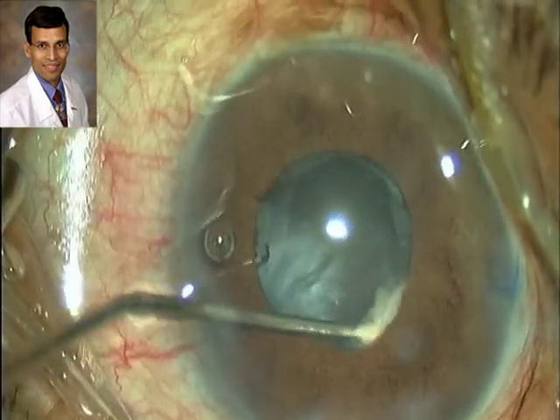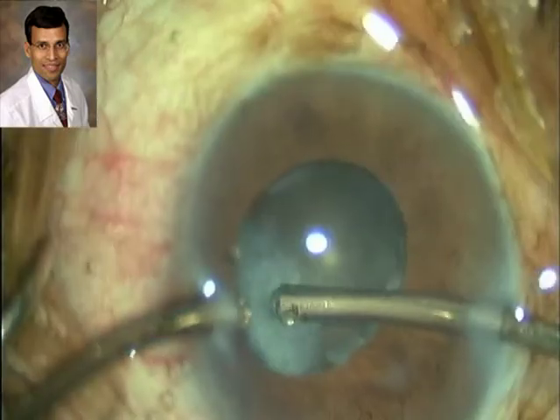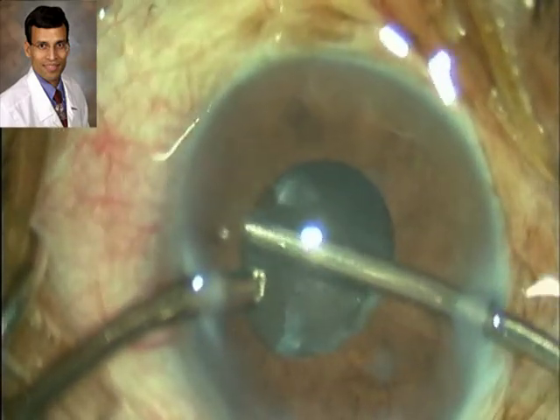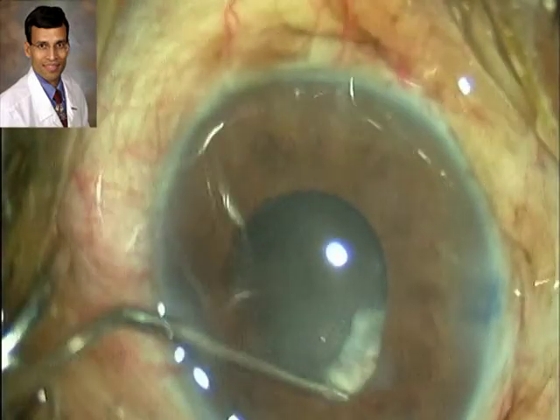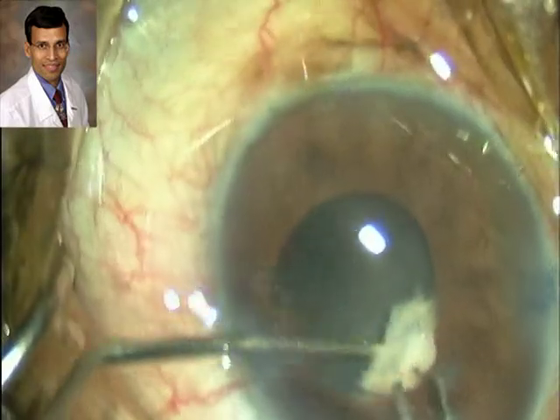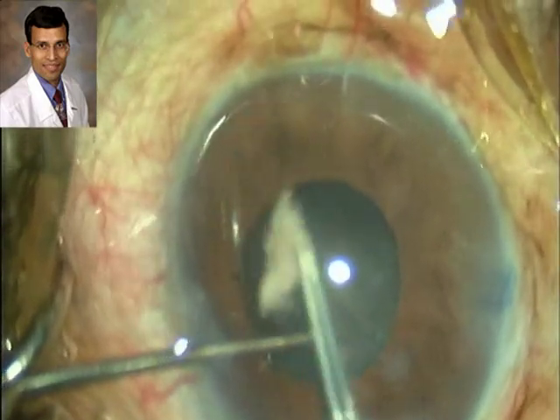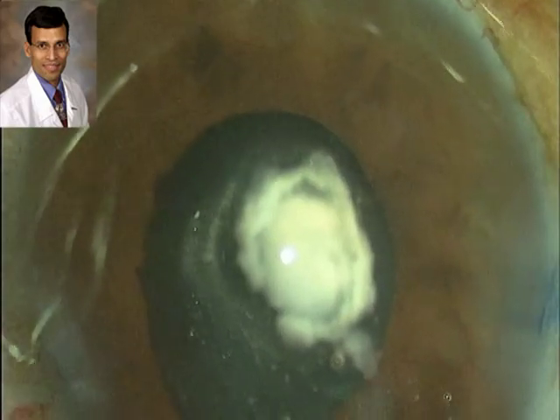Now we can see that there are some membranous bits which are lying under the iris, and they may be very tenacious to remove. We perform an irrigation aspiration, and suddenly we are faced with this capsule plaque that has fortunately come out easily without much manipulation. Otherwise, these capsular plaques on the anterior or posterior capsule are usually very tenacious and extremely difficult to remove.